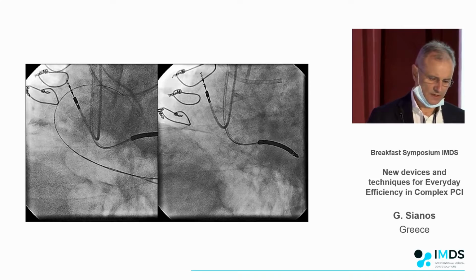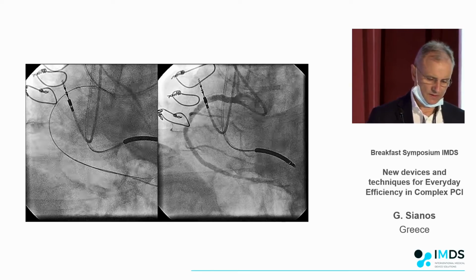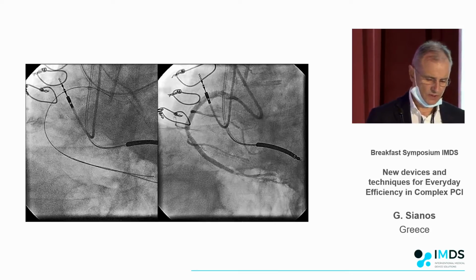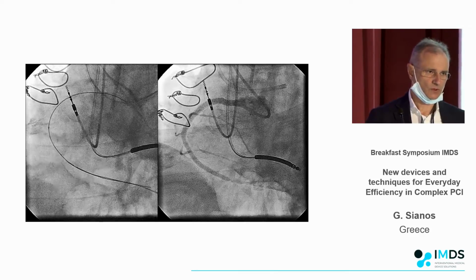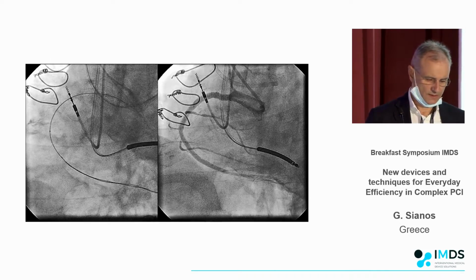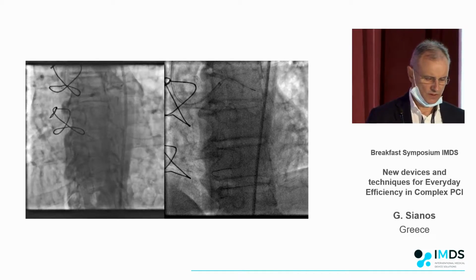You don't see an immediate effect. When you cross, you will not see flow in the majority of cases, because what you create there is a very small lumen, just enough to allow devices to go for further dilatation.